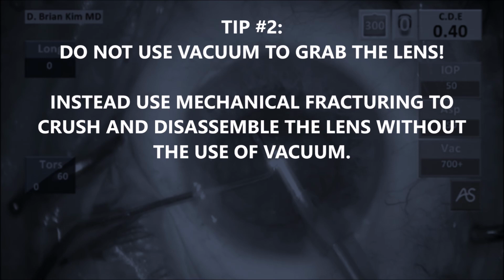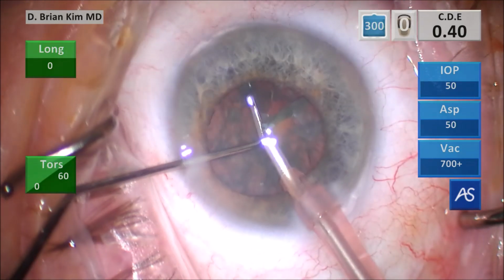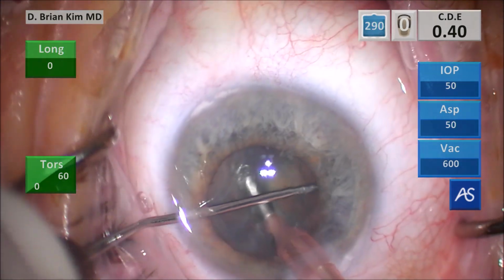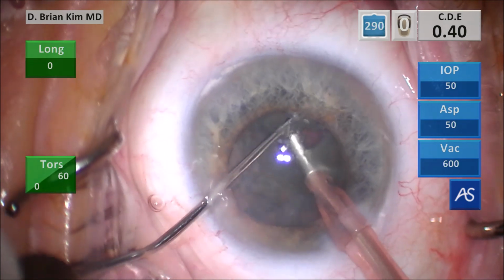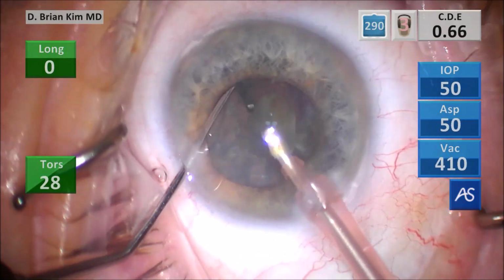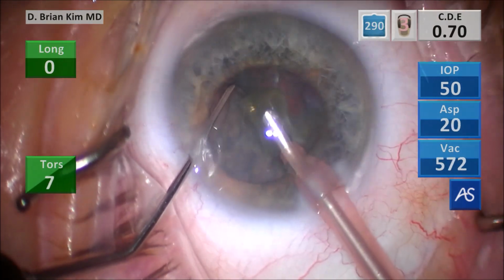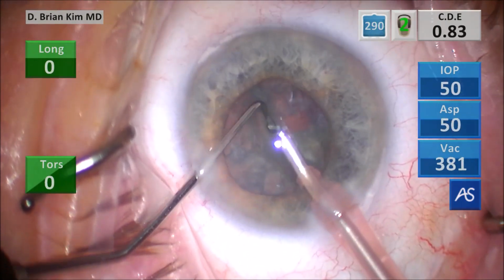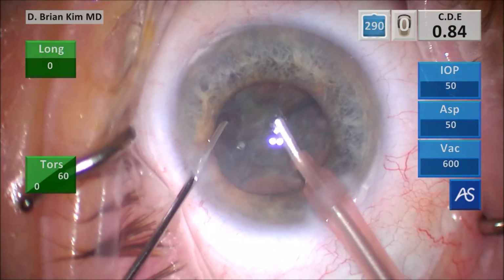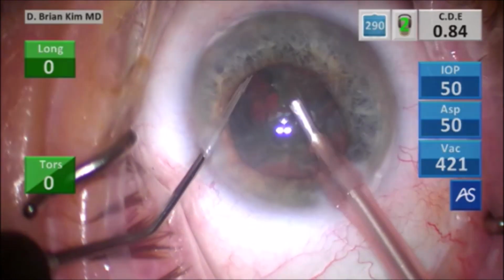And so instead, use mechanical fracturing forces to crush and disassemble the lens without the use of vacuum, as you saw with the technique here. So now I'm placing the chopper around the second quadrant, pulling it centrally toward the phaco tip, and then dividing that lens piece. So again, I'm using mechanical forces, which doesn't require any vacuum with this technique. And by disassembling the lens with a technique that does not require vacuum, I will not grab the pupil. This is tip number 3.